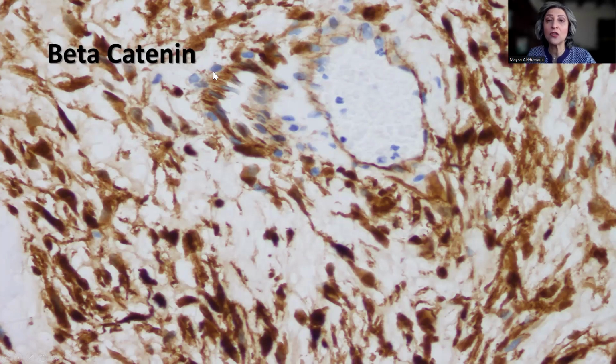Normal endothelial cells and normal lymphocytes that do not stain with nuclear beta-catenin are our negative internal control. And even if you look here, for example, into the vessel, the cytoplasm of the endothelial cell is positive because, as we've said, this is normal staining. Now, in comparison, these are the tumor cells. Where is the nucleus? Where is the blue color like the negative internal control? There isn't any. It's all brown, it's all chromogen, it's all positively staining.